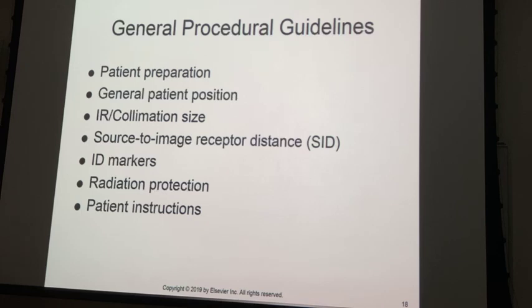And you can even tell without looking at the x-ray that the patient has subcutaneous emphysema. You touch them and they crackle, kind of like a mylar balloon. You know how a partially inflated mylar balloon makes that crackling sound? The patient's skin will do that. It's what they call crepitus.